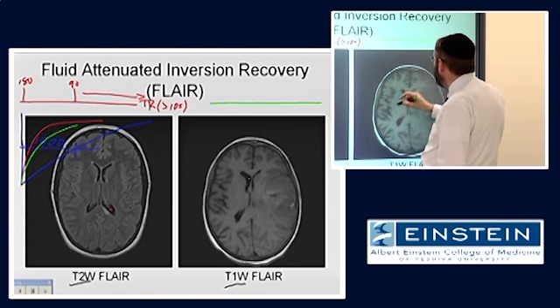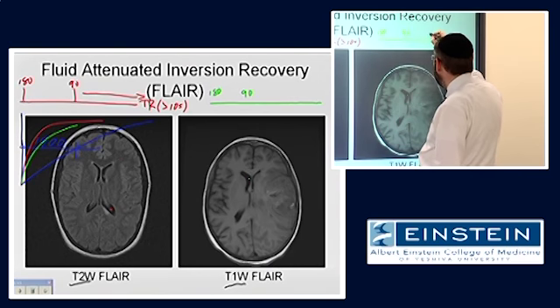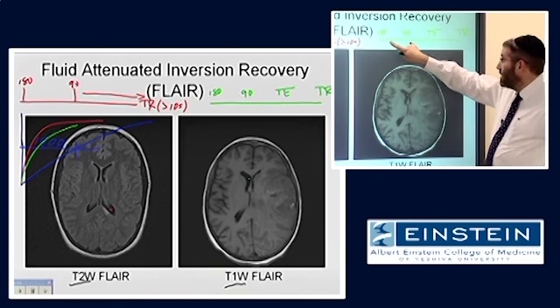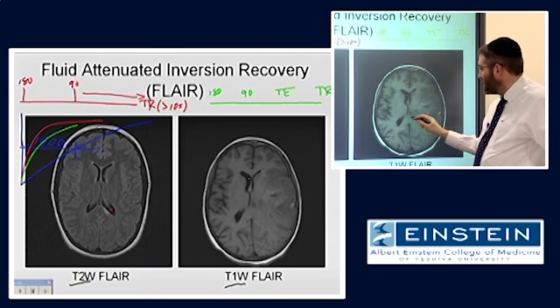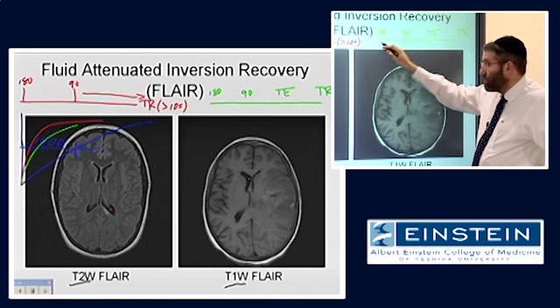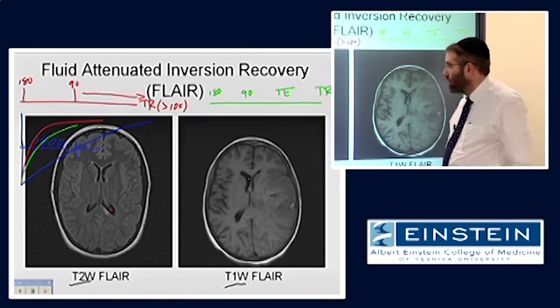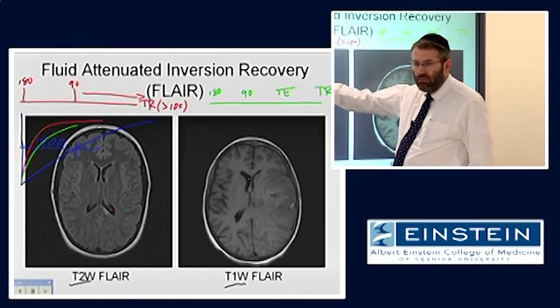It's an inversion recovery pulse sequence where we have a 180, a 90, right, TE, and then TR out here. We still need to have a relatively long TI because the purpose of this inversion recovery piece is in part to suppress CSF. Right? So we still want to get this when CSF is crossing its null point.